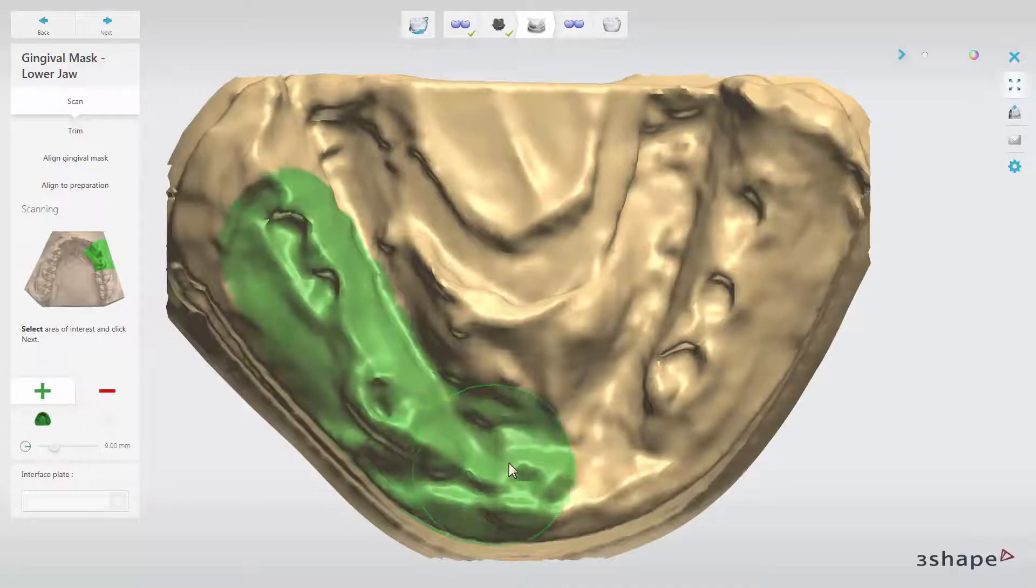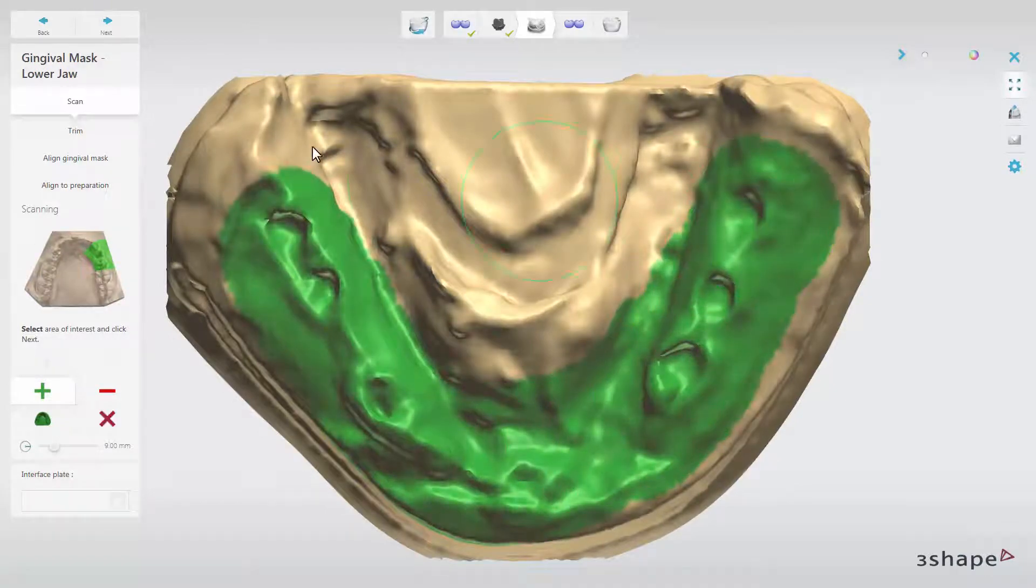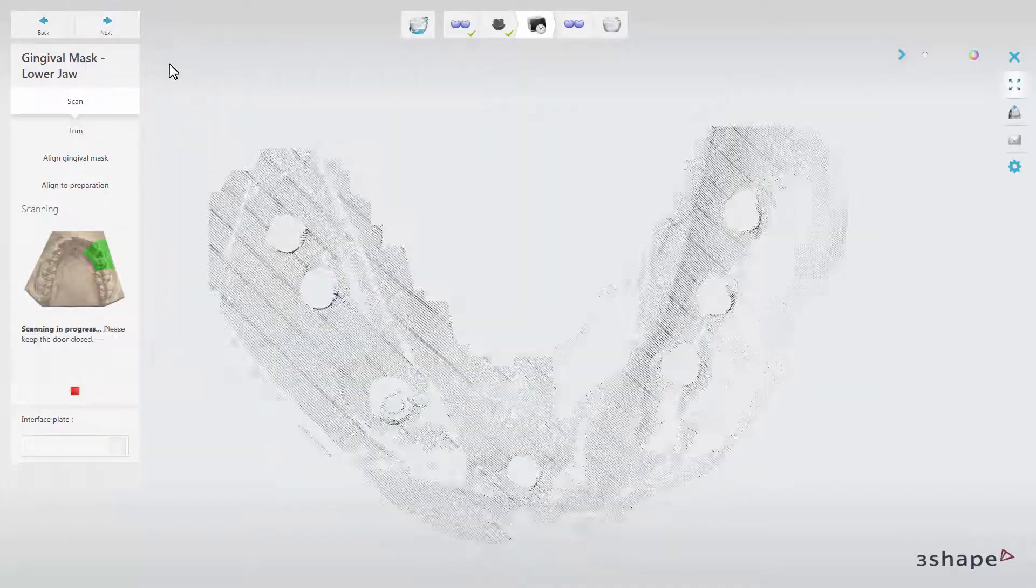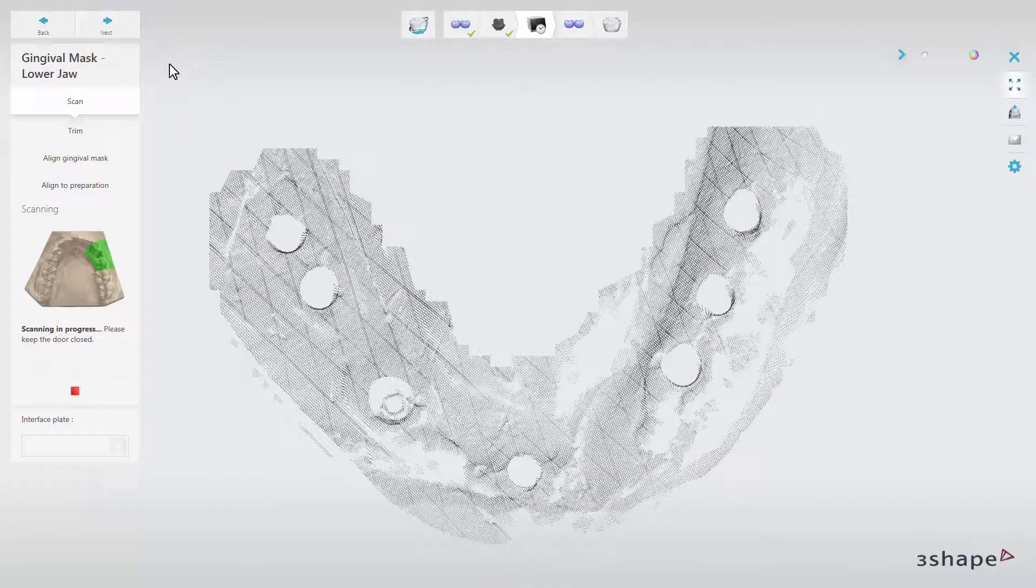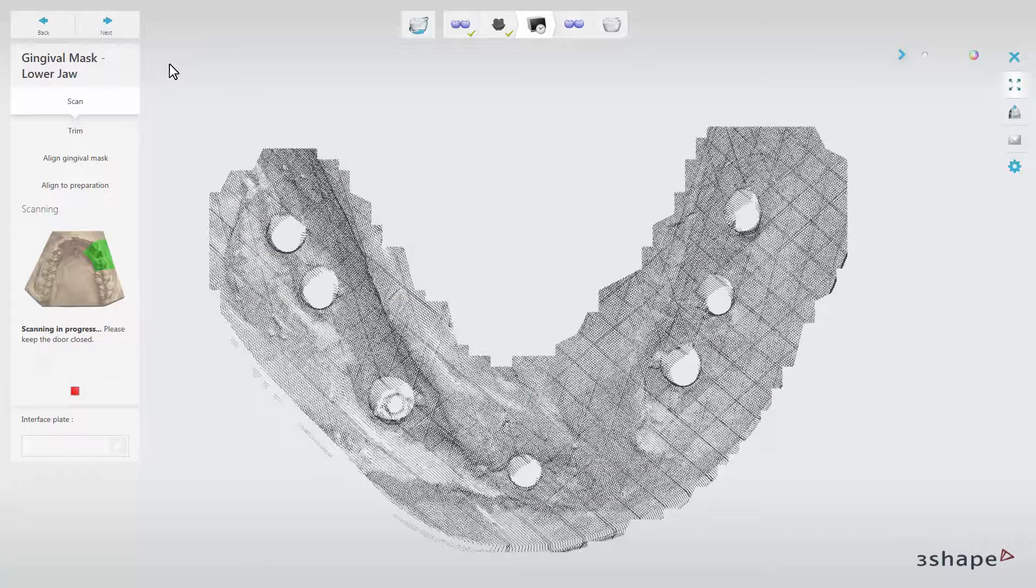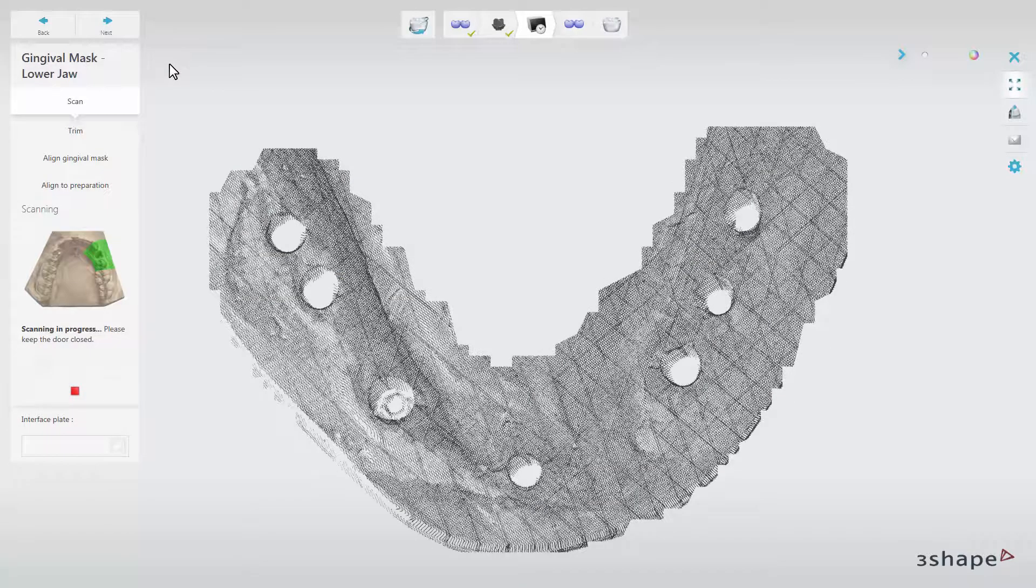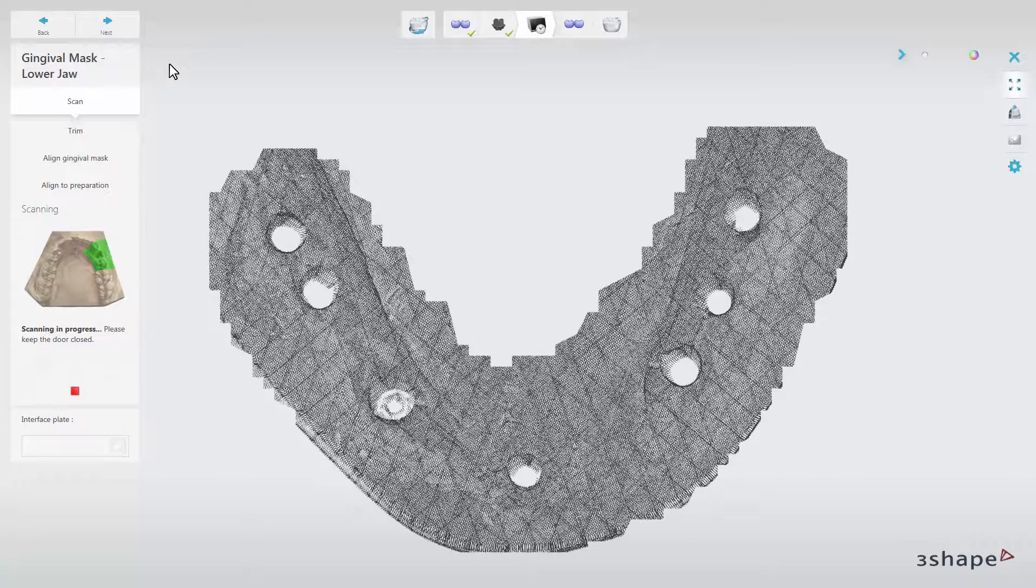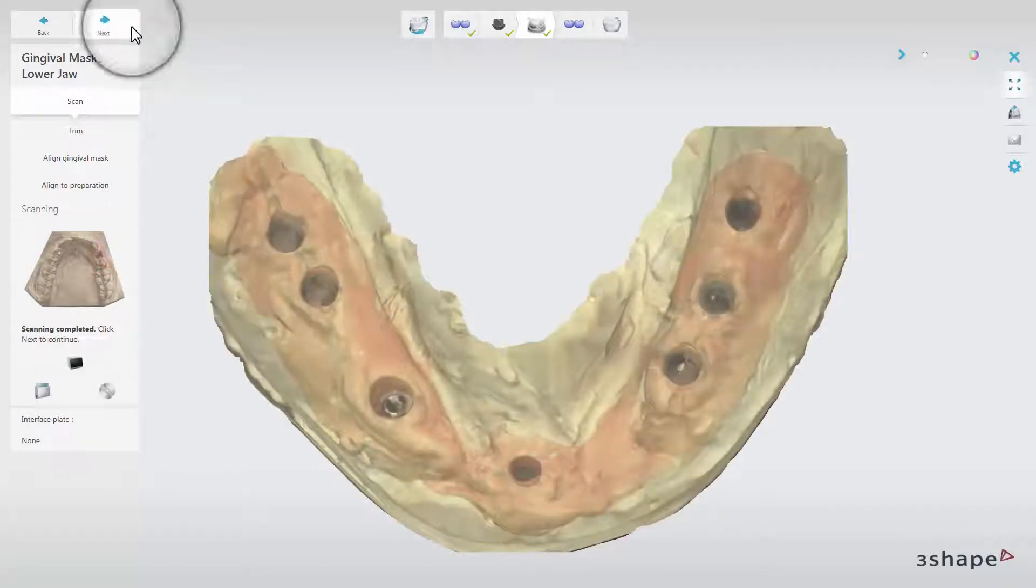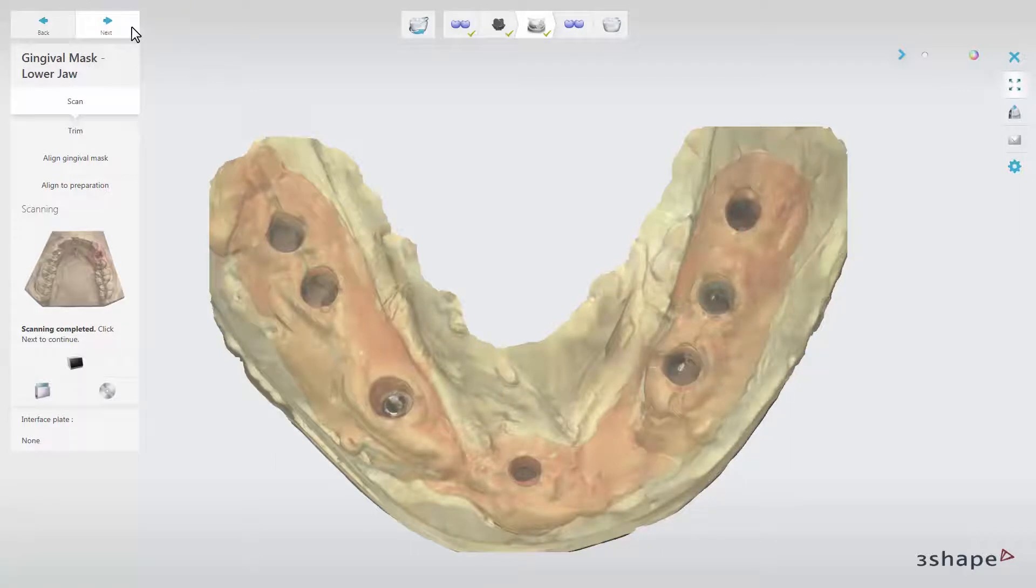As before, select the area of interest and click Next when ready. When scanning is completed, click Next again to move to the alignment sub-steps.